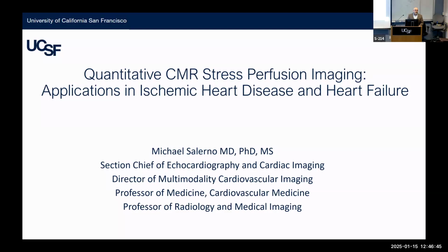The other choice, which people have done also in the nuclear world, would be doing it with dobutamine. With dobutamine, you probably get some more increase in contractility. But then again, what you really want to know is what's going to happen to these patients when they're exercising, and that's when they're having sudden death. So personally, I think vasodilator stress would not be my real choice for those patients, although there's some growing interest in this area.